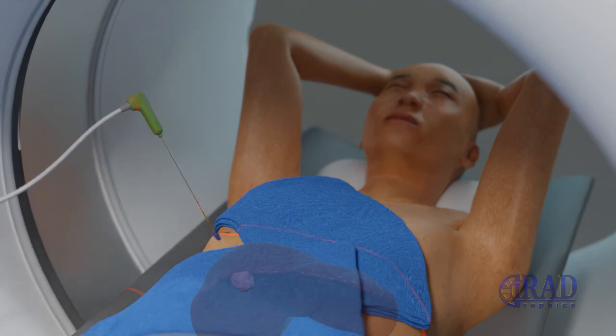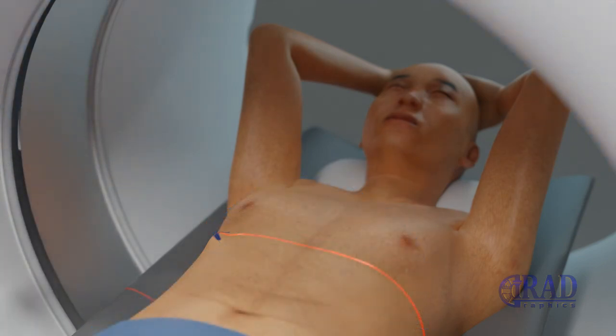At the end of the procedure, the needle is removed and pressure is applied to stop any bleeding. Subsequently, dressing is applied at the opening in the skin. The entire procedure usually takes 1 to 3 hours.